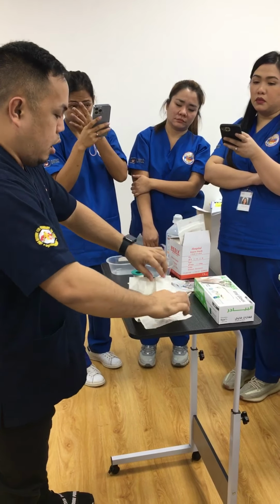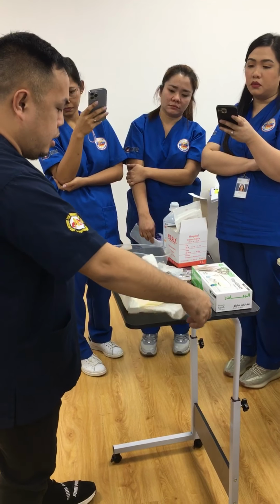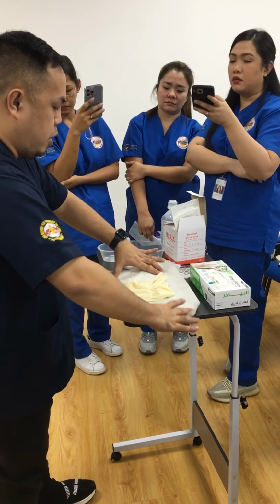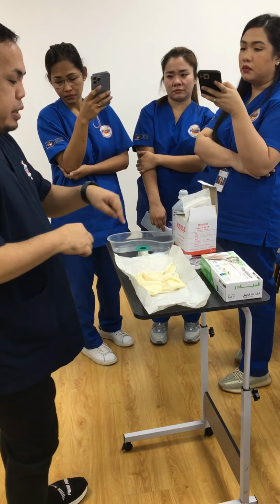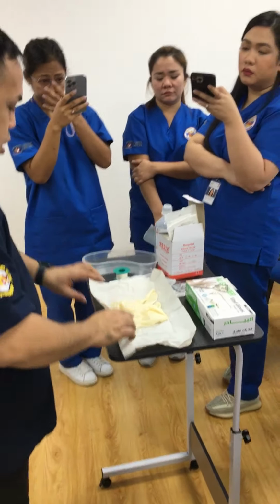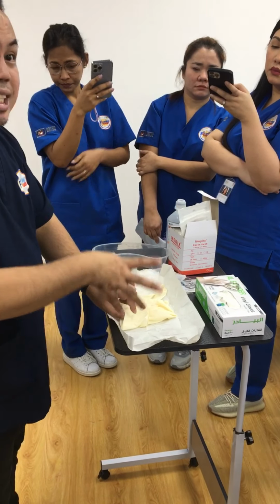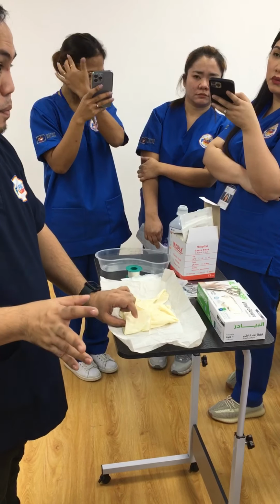So when I open the sterile gloves after the hand washing, this is the surgical glove, right? I will have to identify which part of this glove is sterile and which part is unsterile. This part inside the gloves is considered the unsterile, not clean.